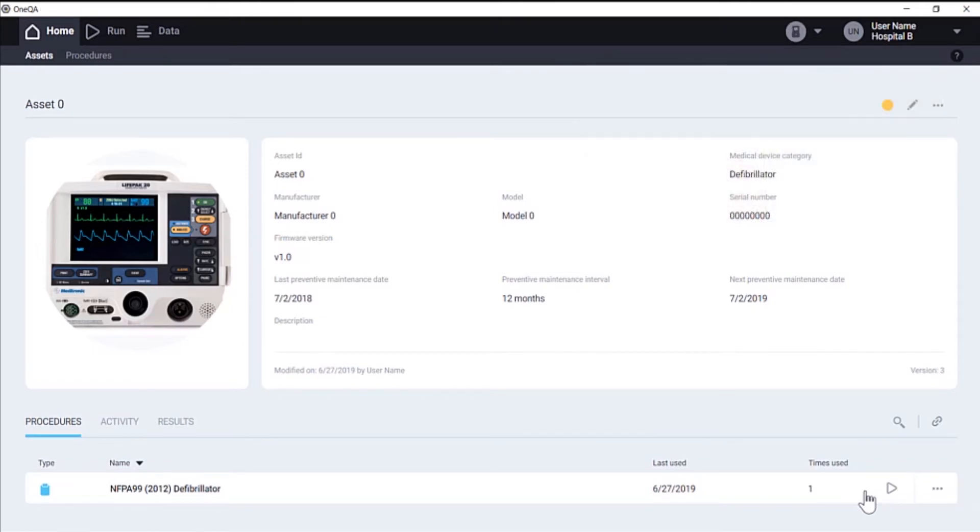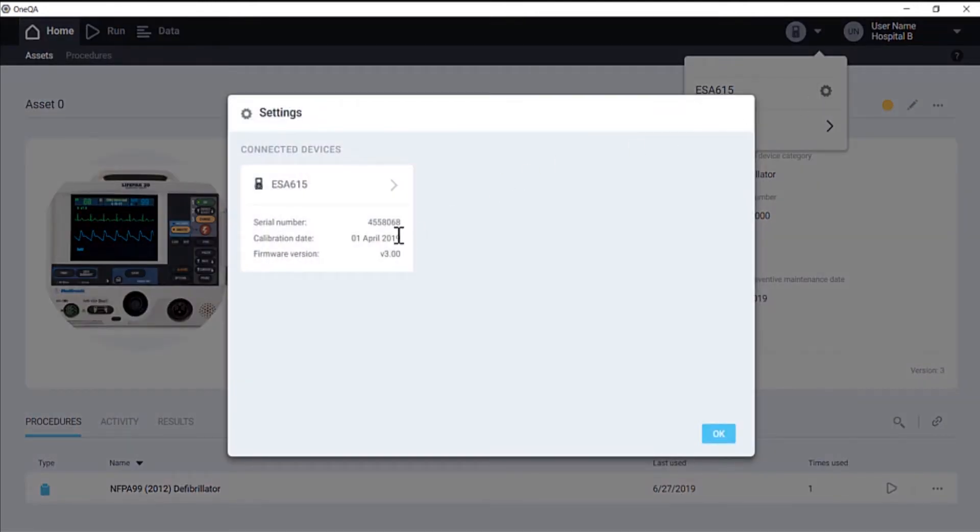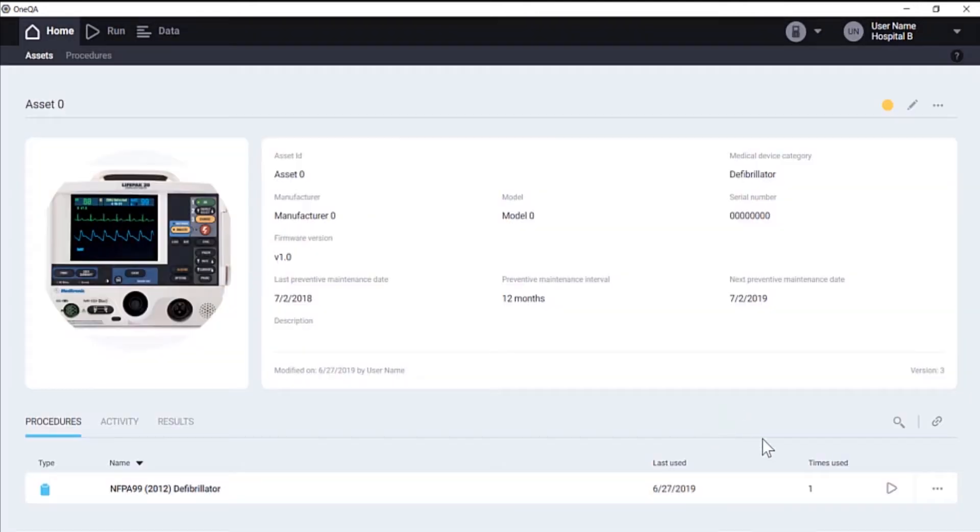After a few moments, the test device will be detected by OneQA and appear here along with test device information. So we can now run the procedure.